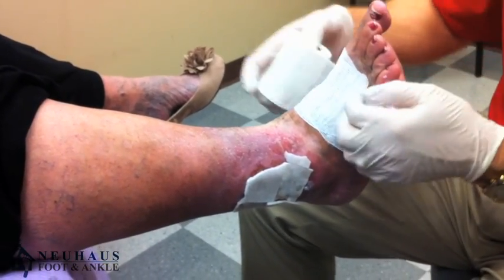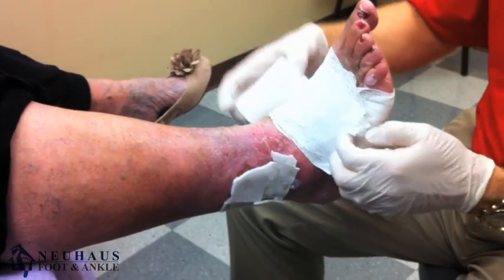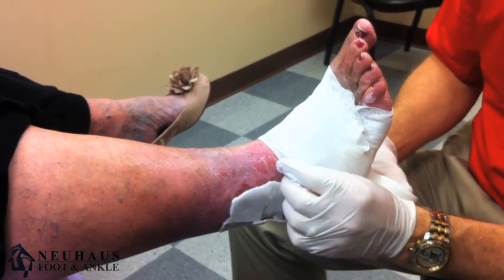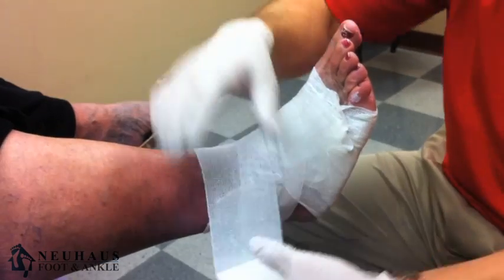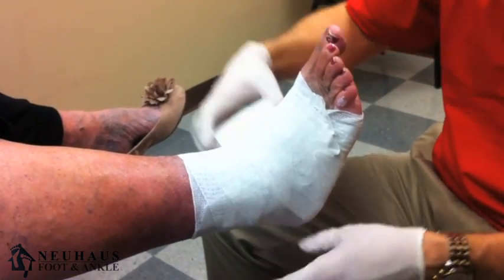You have to control the swelling — that's really the trick with a venous stasis ulceration like this, is to control the swelling. People that have this problem, you can see the leg is very swollen, it's red, it drains a lot. By wrapping it with the Unaboot, you compress that and get the fluid out of it, squishing the fluid up the leg.